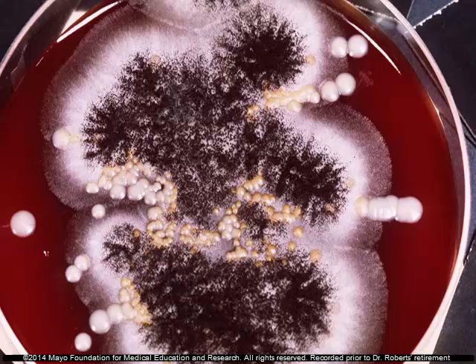First, we're going to discuss how to make mounts for a fungal culture so that we can make an accurate identification. This image you see here actually is representative of what happens in the laboratory many times, where a plate is contaminated with many organisms and you need to figure out how to identify those that are present.